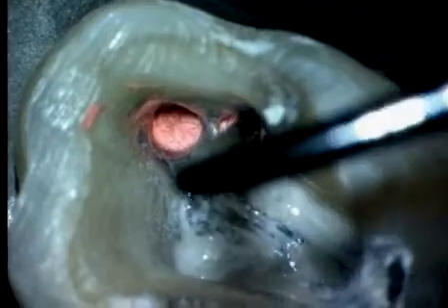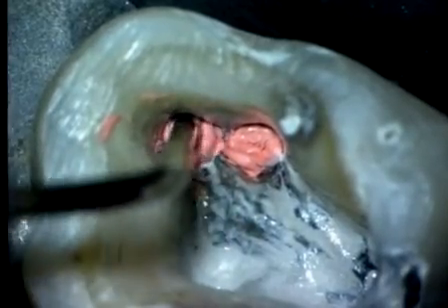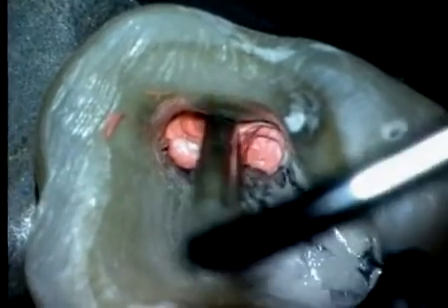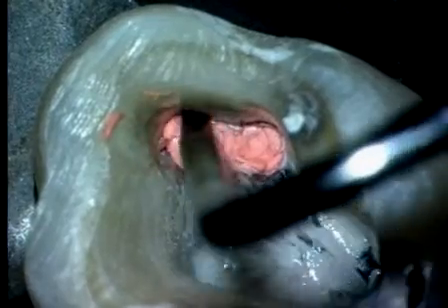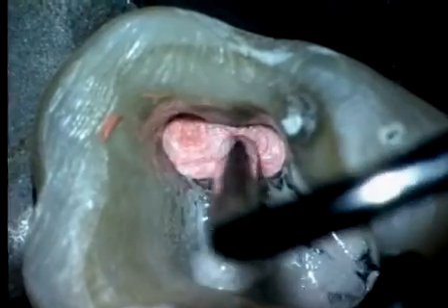During the backpacking technique, gutta percha is condensed until the clinician feels it becomes firm. Progressive injection of thermosoftened gutta percha continues into the coronal 1/3 of the root. The largest size pre-fit plugger molds this gutta percha into this space and levels it off at the pulpal floor. This completes the backpacking technique.